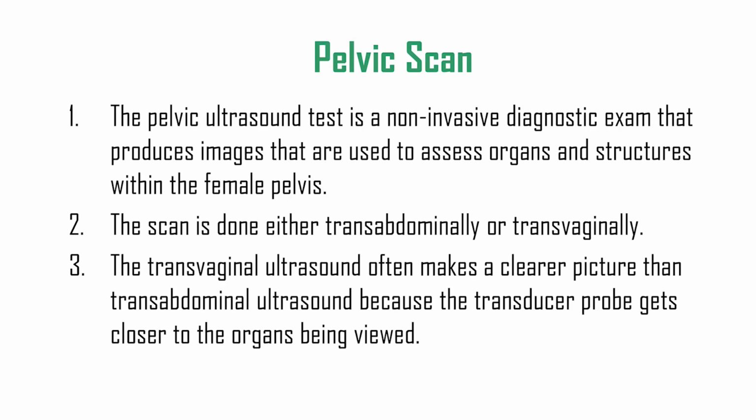Pelvic scan. To summarize, the pelvic ultrasound test is a non-invasive diagnostic exam that produces images that are used to assess organs and structures within the female pelvis. The scan is done either transabdominally or transvaginally. The transvaginal ultrasound often makes a clearer picture than a transabdominal ultrasound because the transducer probe gets closer to the organs being viewed.